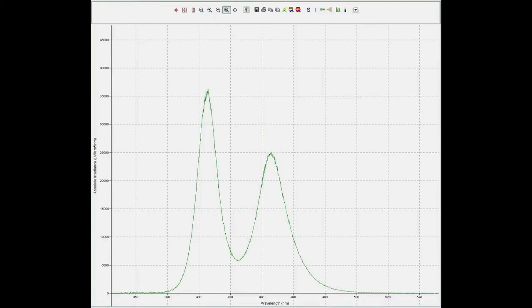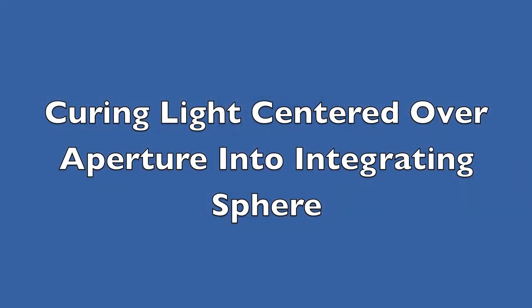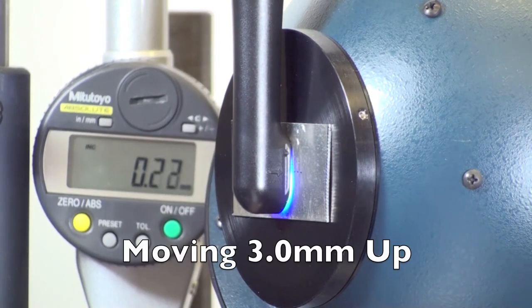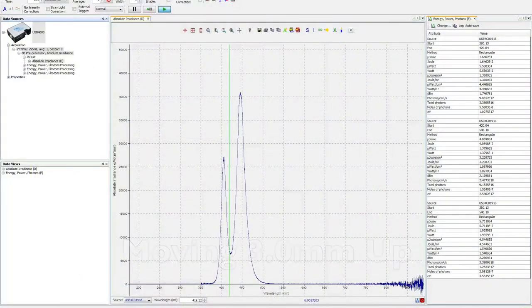As you can see, as the light is moved over the sensor, the spectral emission changes quite dramatically. Here we see an integrating sphere with a 4 mm diameter aperture. We're now going to centre the curing light over this 4 mm diameter aperture and move the curing light 3 mm up. As we move the curing light up, we can see that the spectral emission received by the integrating sphere changes quite dramatically and the ratios of the peaks changes.